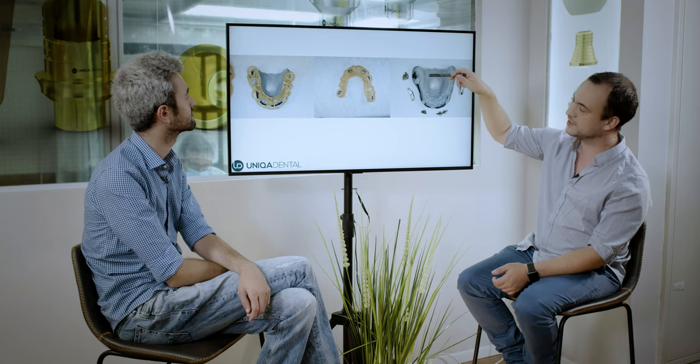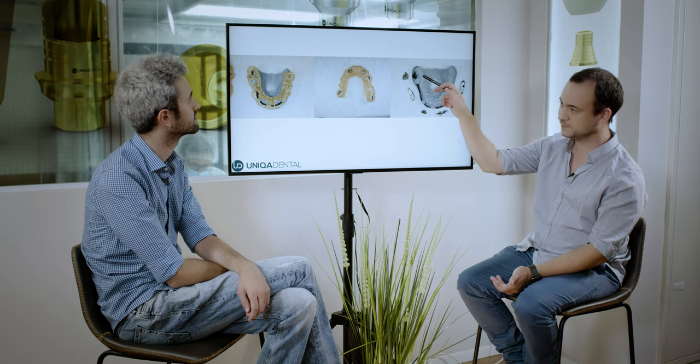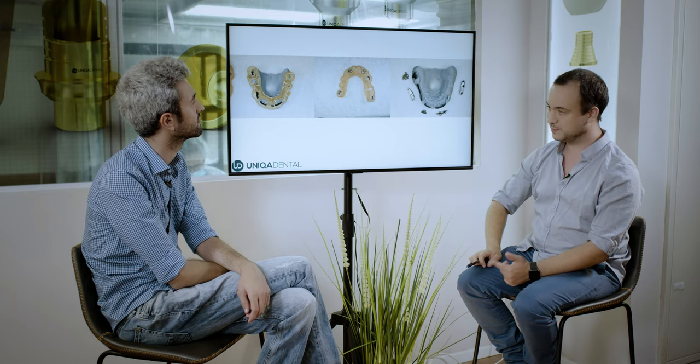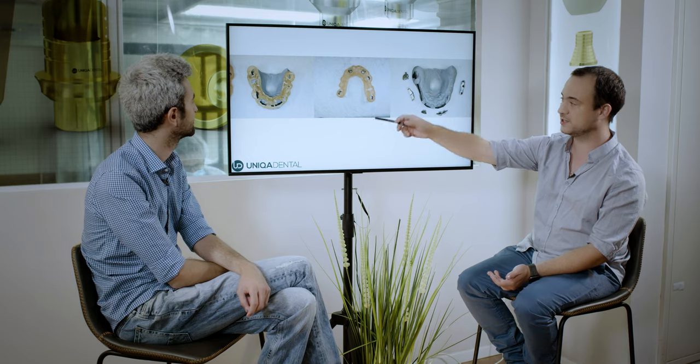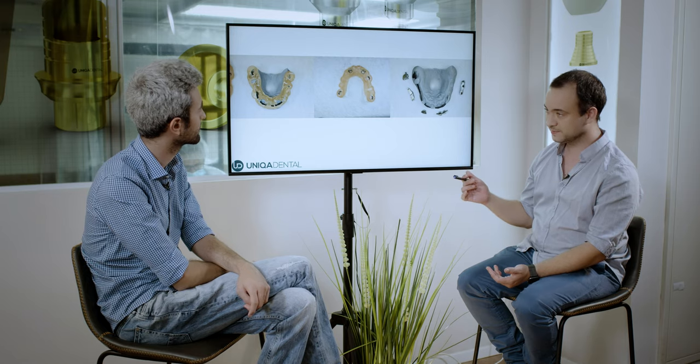These parts in the mouth need to be extracted — you need to cut these parts of the bar and extract these teeth so you can place implants instead. But first you need to cut the bar, because when you place the surgical guide on top of the bar there is a bar in the way — you cannot touch the teeth otherwise. We made the planning of the implants on top of that bar, but in the surgical process itself you need to cut those parts to place the implants.